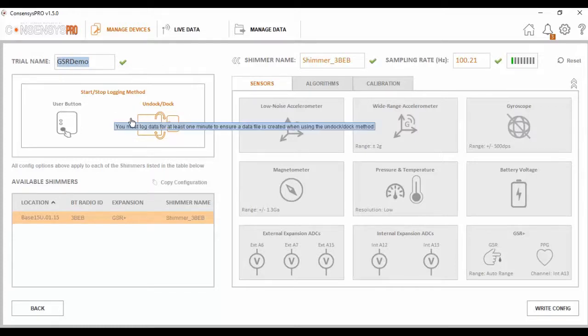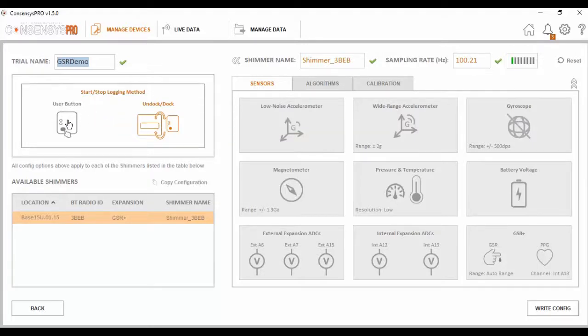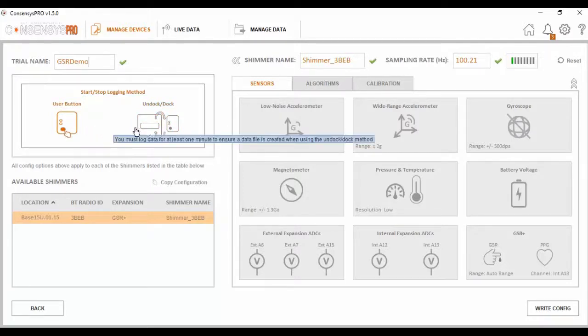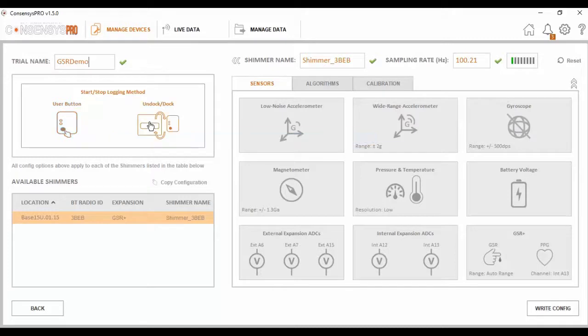Following this I want to consider what logging method to use. With the Undock Dock method, when I undock the Shimmer from the consensus base, it would automatically start logging data to the inbuilt SD card on the unit. With the user button option, the orange user button on the Shimmer acts as a start and stop button. For the purpose of this I am going to use the Undock method.